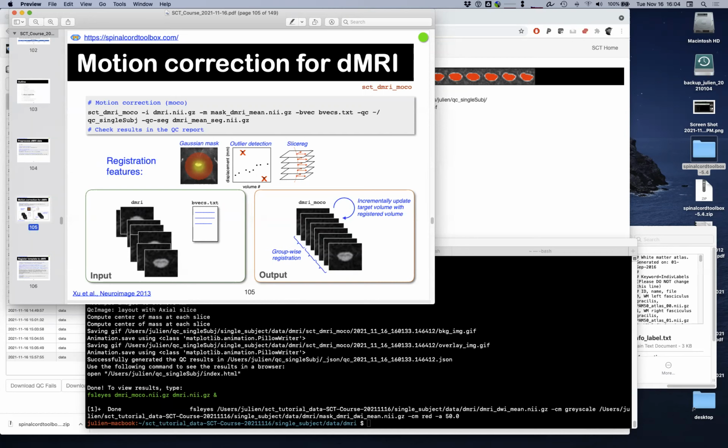It depends what kind of analysis you want to do. For the spinal cord, I usually discourage people from doing tractography for a couple of reasons that I won't go into now. If you want to compute metrics such as DTI FA, that's not a problem. There's no need to reorient. Actually, you would normalize them after calculating them in the individual space. Correct. Okay. Thank you.